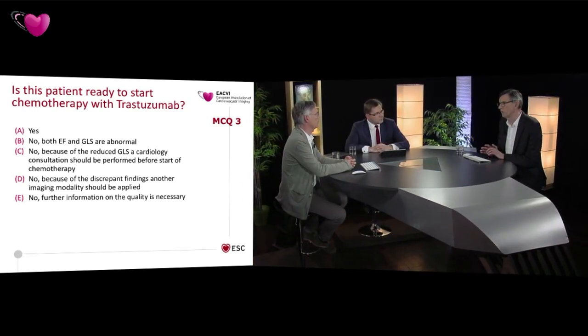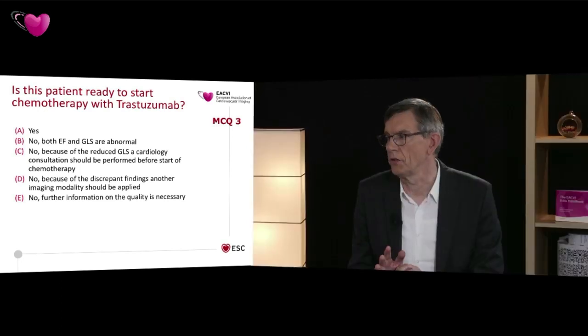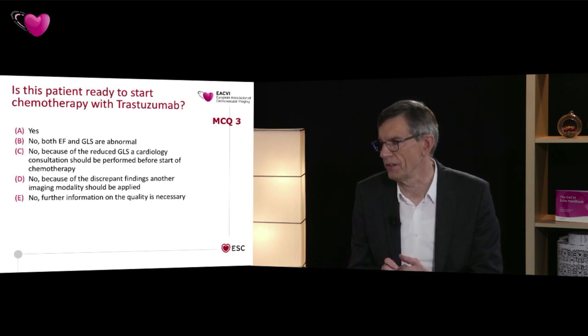In our institution, we do the global longitudinal strain on the non-contrast images because the strain algorithms do not work well with the contrast. They are not adjusted to the contrast in the ventricle.